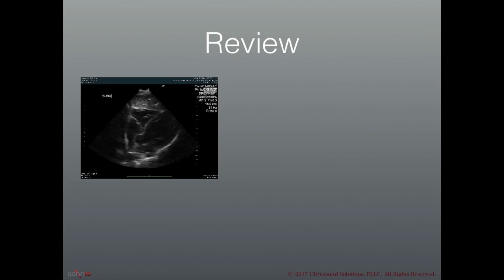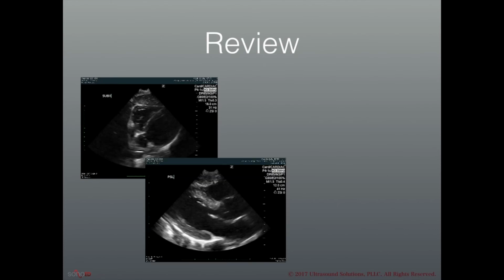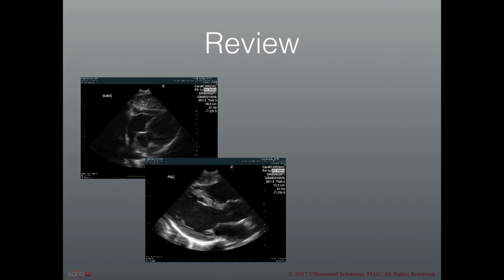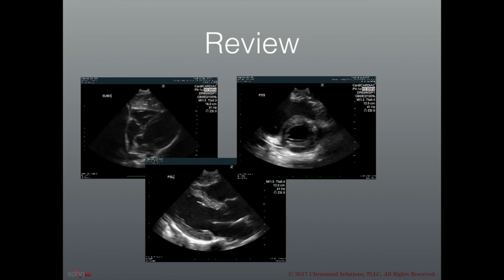Here's an example of a normal subxiphoid view with the apex of the heart pointed towards screen right. Here's a parasternal long view with the apex of the heart on screen left. Here's a parasternal short view.